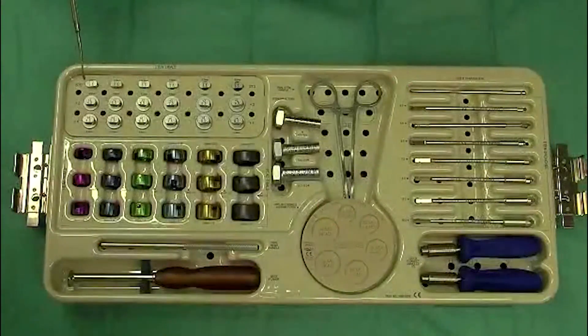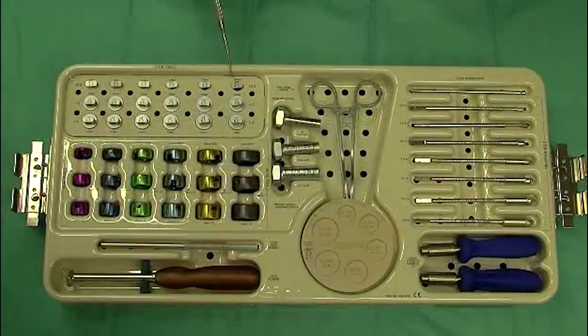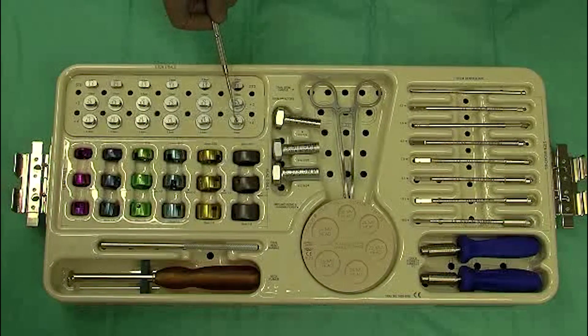We have stem sizes from 4.5 all the way to 9.5 millimeters. They come in standard, plus 2, and plus 4 lengths.